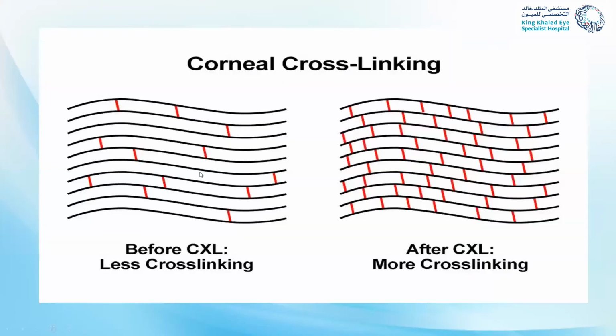So this is what happens. You can see here the collagen fibers are quite far away from each other. And this is after, when lots of new covalent bonds have formed between the fibrils, and you can see how they're all put together and compressed with each other.